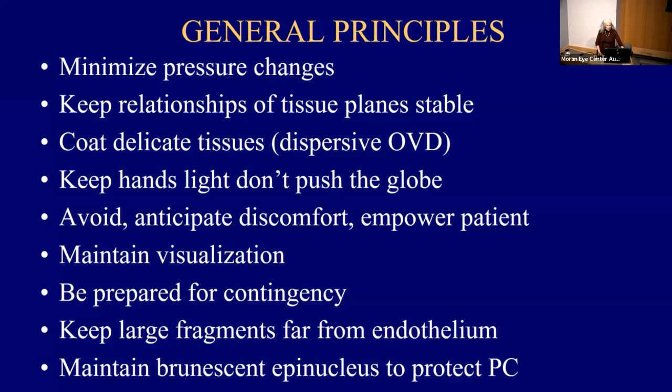We want to coat delicate tissues, and we have the advantage of the Arshinoff soft shell that we can use dispersive OVD and work within cohesive, which is my preference, though certainly there are many ways to skin that cat.